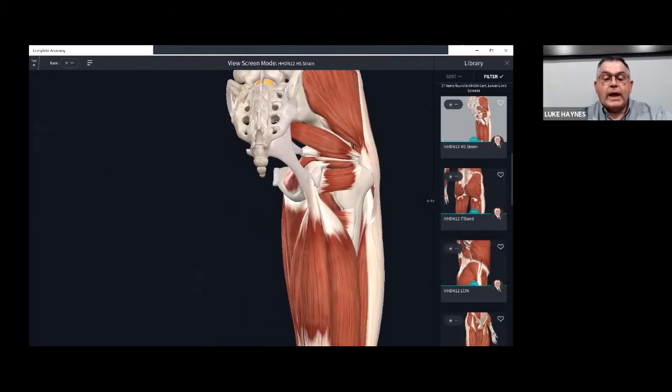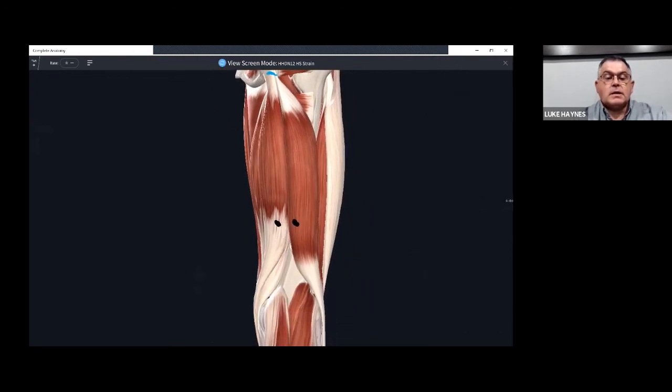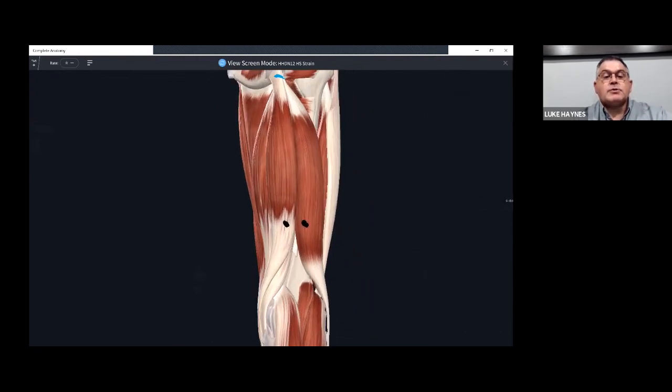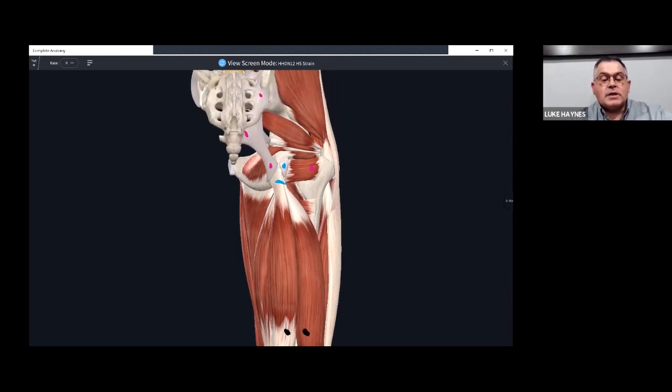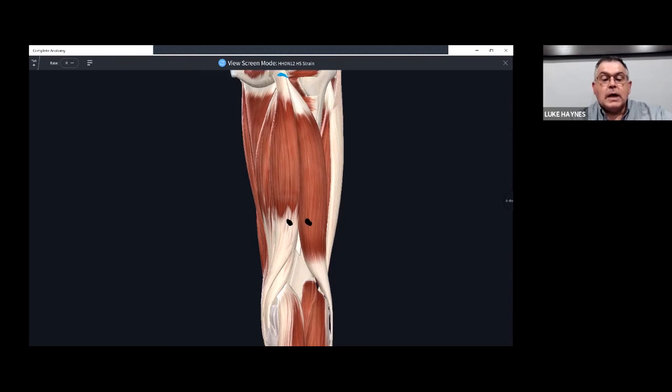So for the hamstring strain, we'll start with the distal hamstrings at the V notch from lab. You'll remember we drew this out and needle just a finger breadth away from midline. So we'll catch the hamstrings there. Absolutely, if we're palpating and we feel more of a ropey structure inside the muscle more proximally, we can needle in there. There's no reason not to. But that's our primary down in the hamstrings.